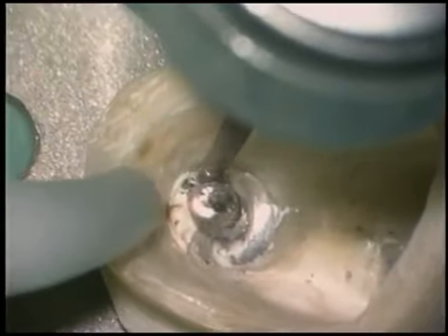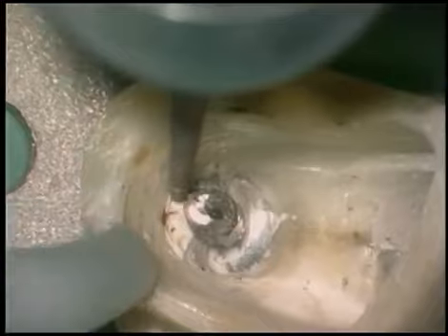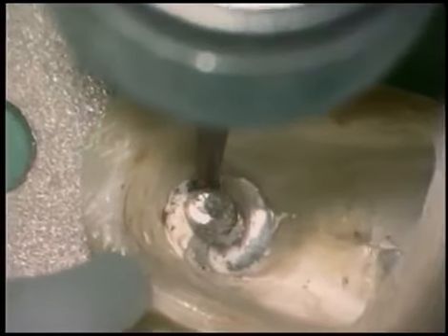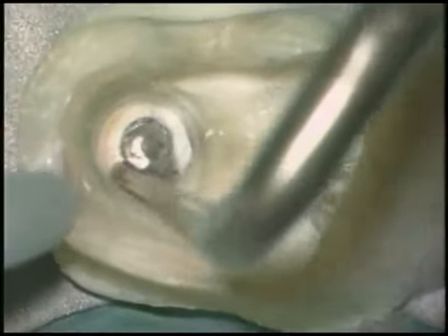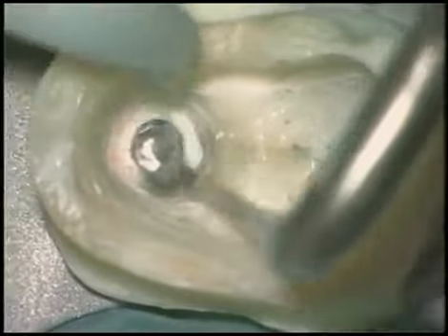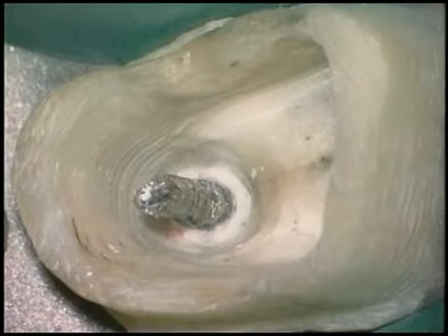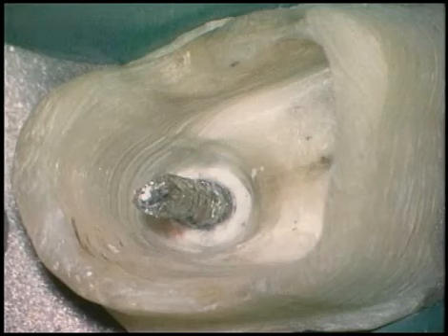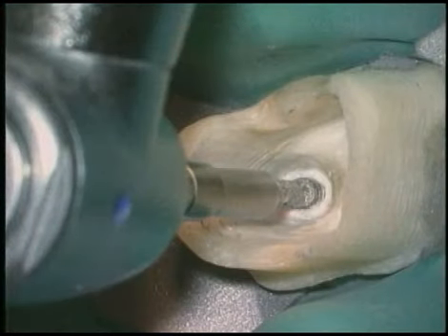If space exists between the axial wall and the post, use appropriately sized surgical length carbide round burs or thin tapered diamonds to eliminate remaining buildup material. Once we've eliminated the bulk of the amalgam, and if space exists, use ultrasonics below the orifice to remove restorative materials. When fully exposed, vibrate the post up to 10 minutes with the Endo 1. If the post doesn't budge in that time, then we need a fallback option.